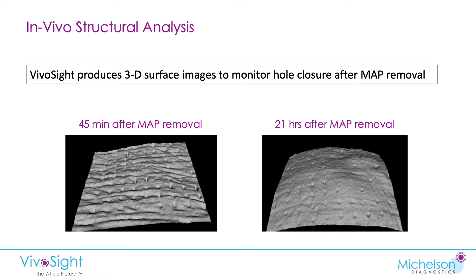First we can look at the holes or pores left by the microneedle array post removal. This image produced by the VivoSight shows the surface topography of the skin, and you can see the individual pores left by the microneedles. When we repeated the scan 21 hours later, they're still there but they've really subsided in depth.